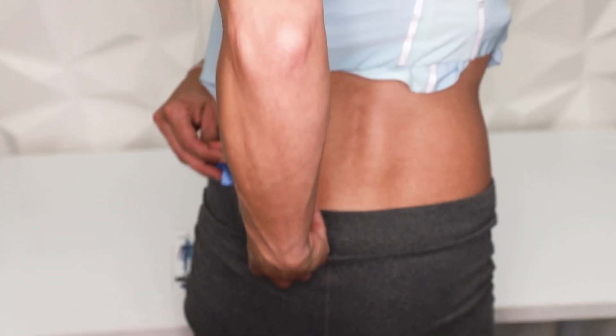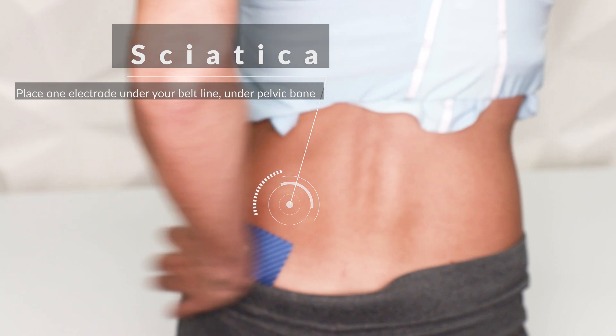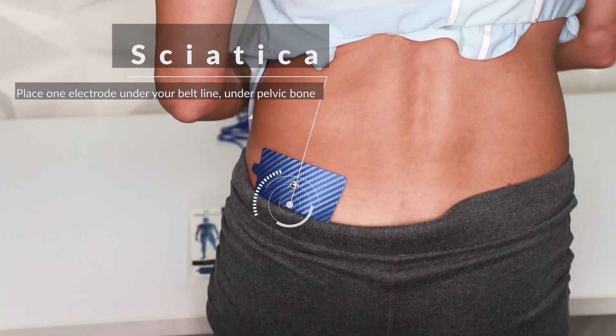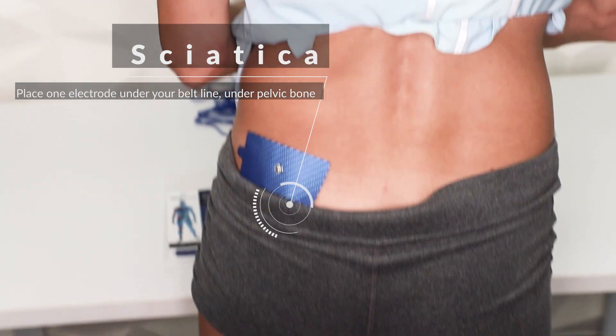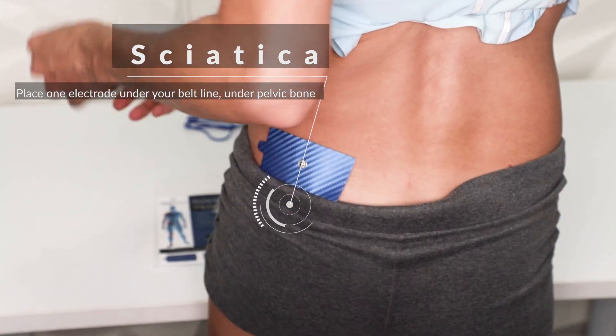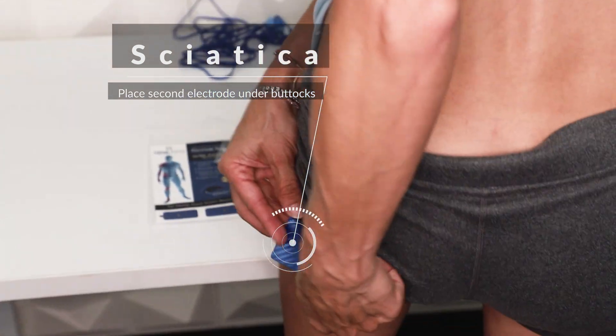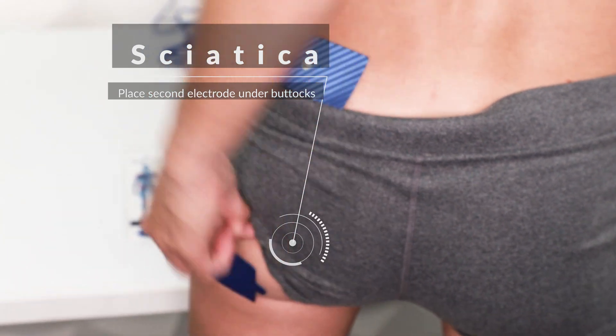If you're having sciatic pain, place one electrode posterior to your pelvic bone, right next to your spine, below your belt line. Place your second electrode on the outer edge of your back. Going straight down from that electrode, place one under your buttocks and one on the interior side under the buttocks.